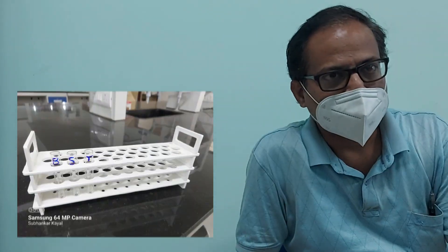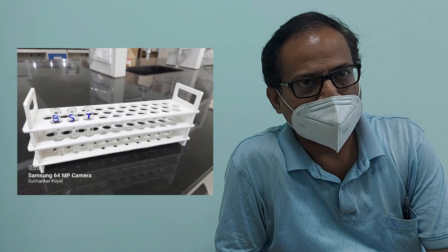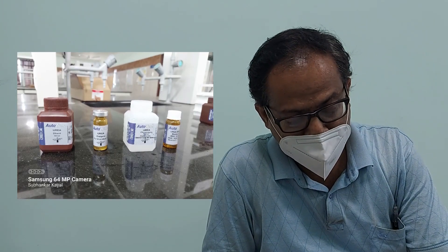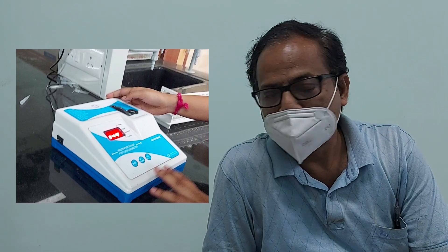Instruments required for this test: first, three test tubes — one for blank, one for standard, and another for the test solution. Second, a urea kit which contains buffer reagent, enzyme reagent, chromogen reagent, and urea standard. Next, we need a colorimeter, which is the most important part of the test.